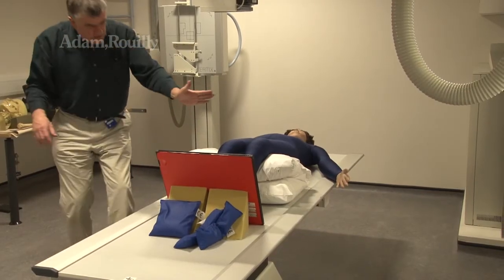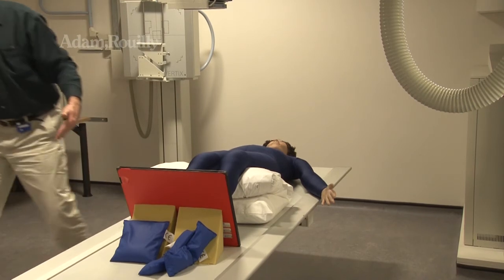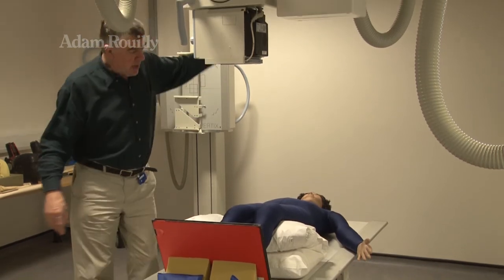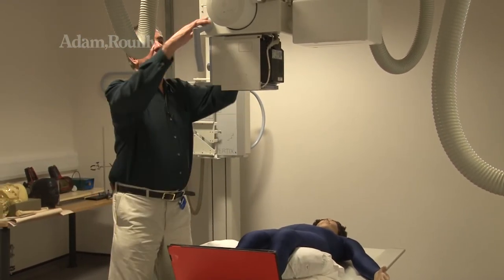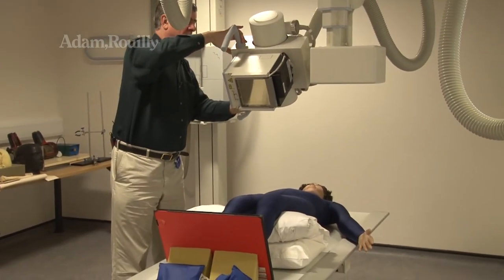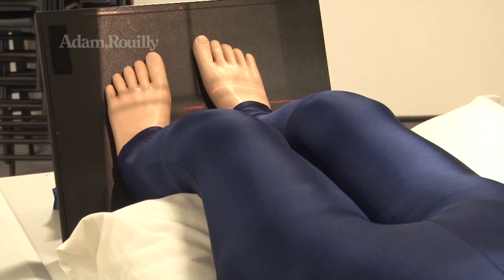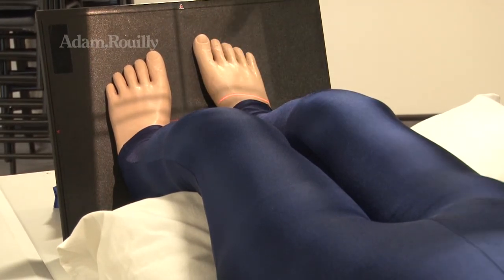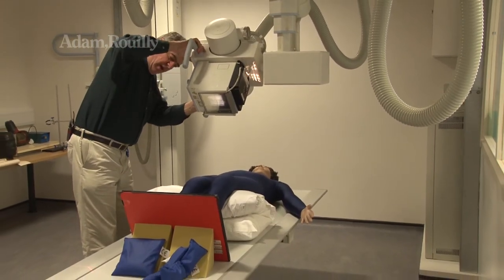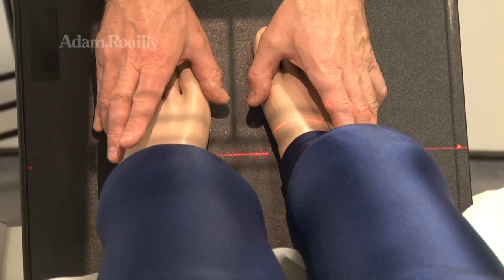So now we can see, and the feet are here now. I know you can't see, but in a symmetrical position. So we're looking at your feet as though you're looking from this direction. And this time I can now move the X-ray tube, and I'm going to come in from this angle. So I can tilt the tube. Highly maneuverable. Making sure the feet are together, final adjustments. And again, adjusting the collimators to the required area. Like so, final check.